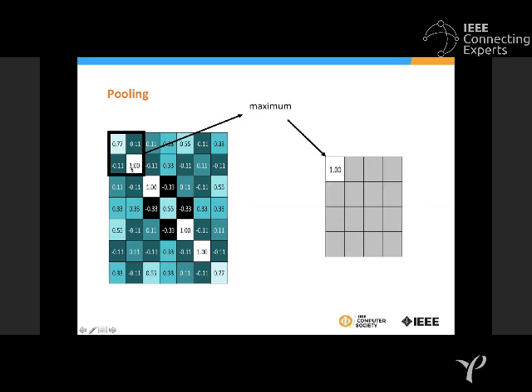If you look at the pooling, it works on a window, and within this window, it tries to take the maximum value. In this window, you see that 1 is the maximum value. So instead of all these values, I can just say, look into this particular region, and I know there is a good feature outcome here because at least one value has a 1. It is sufficient to record that this region has a good feature outcome, and hence I store the value 1, the maximum value of the outcome of the convolution filter. And in this way we go on doing this.